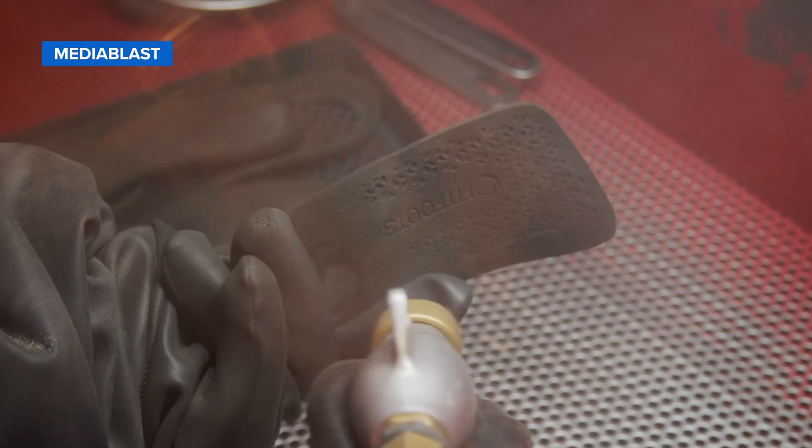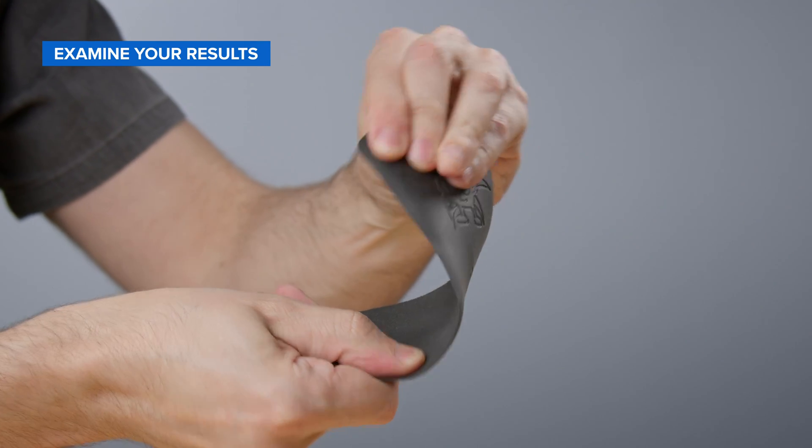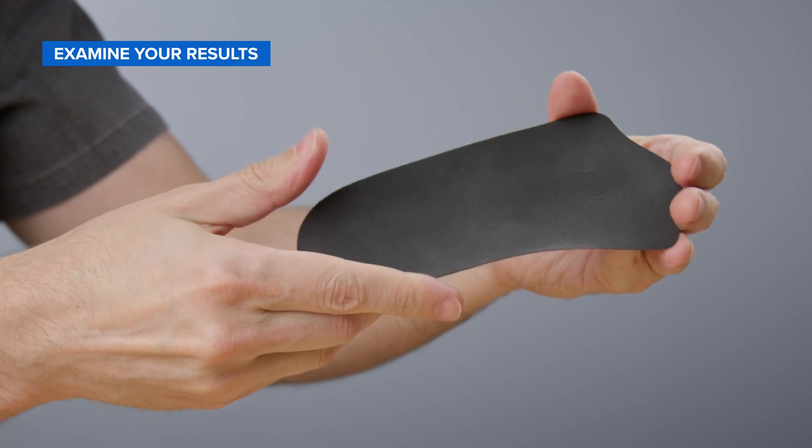To fully depowder your insole shells, we recommend using a media blaster as the final step. Glass beads will help remove residual powder from the surface. The final result? Highly ductile insole shells that are ready to integrate into your final product.